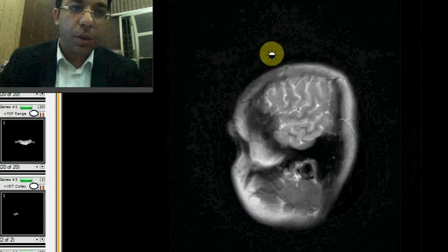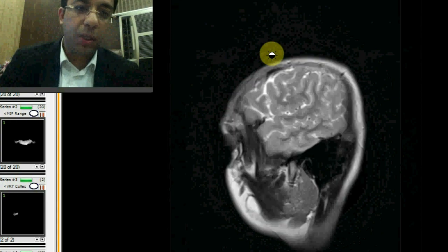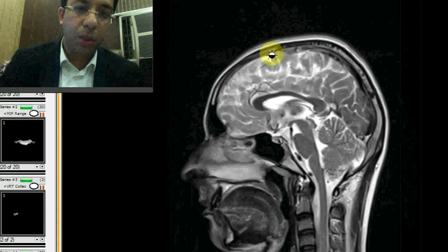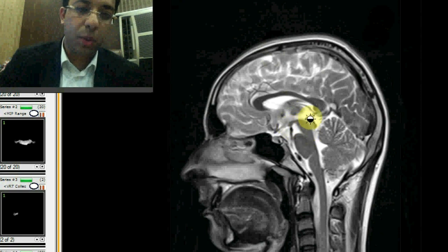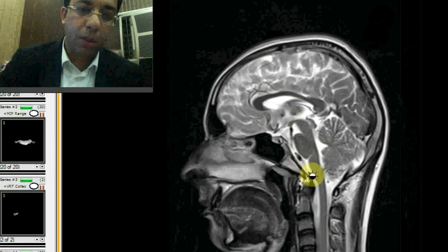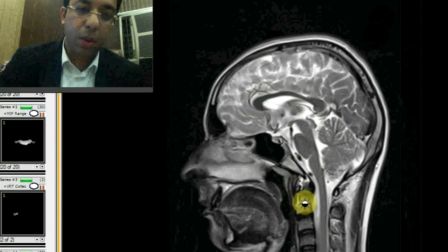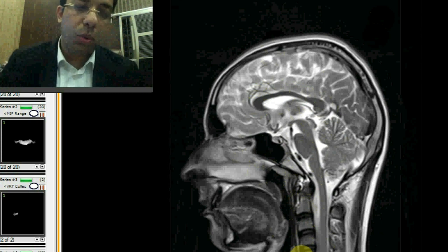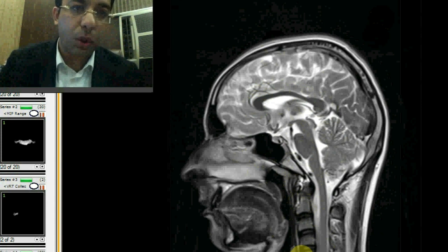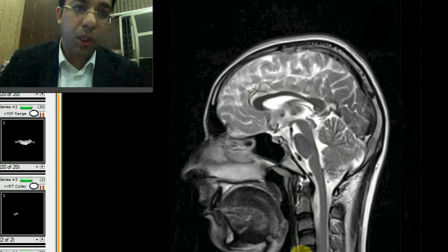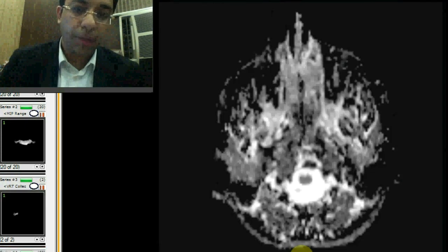A routine MRI brain also includes a sagittal image. On this sagittal T2 weighted image, you can see the midbrain, mammillary body, superior colliculi, inferior colliculi, aqueduct, fourth ventricle, third ventricle, pons, medulla, spinal cord, pre-pontine cistern, basilar artery, cerebellum, splenium of the corpus callosum, corpus callosum, sphenoid sinus, clivus, atlas, and odontoid process of C2. MRI is a multi-planar modality — you do coronal and sagittal images as well, and gradient sequences for hemosiderin or blood products.